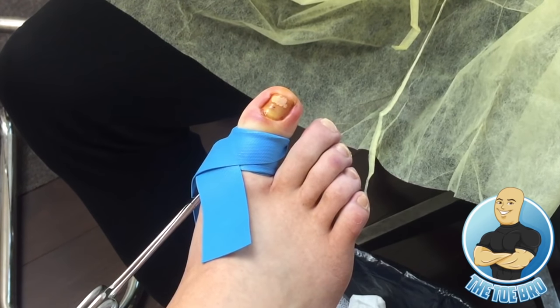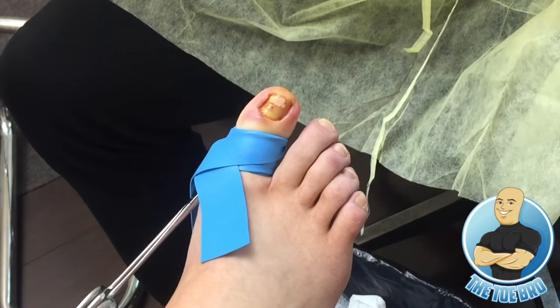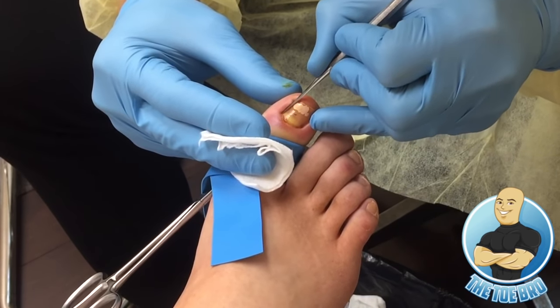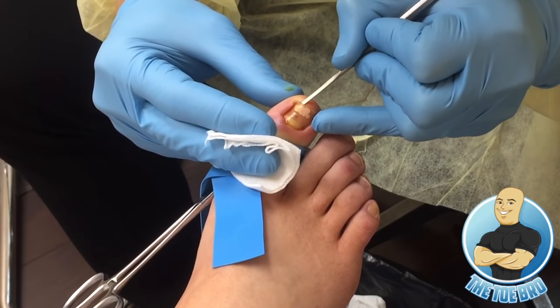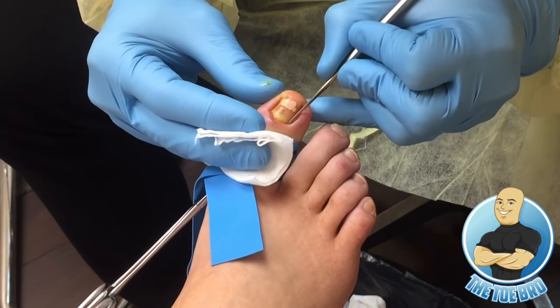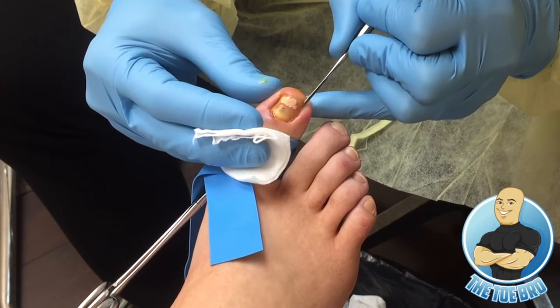After wiping down the toe with a betadine scrub, I always like to do a second test to the toe to make sure that the toe is completely numb. I usually do a first test with a toothpick before I even put on the tourniquet, and this is the second test I do with the toe slightly covered just to make sure they're completely numb.